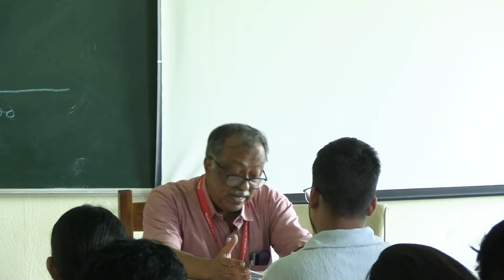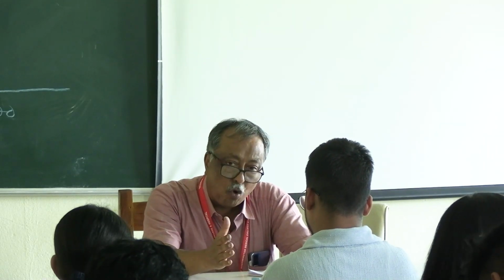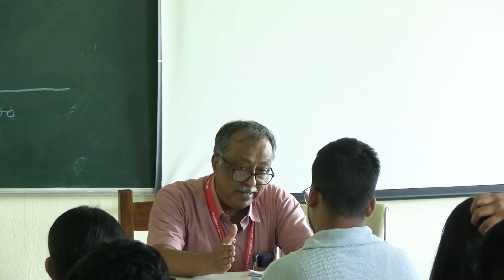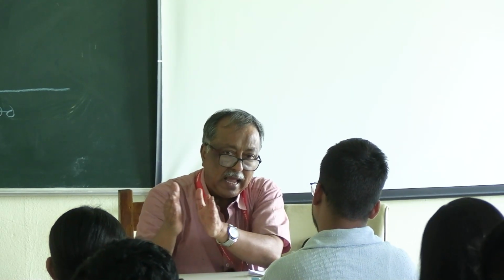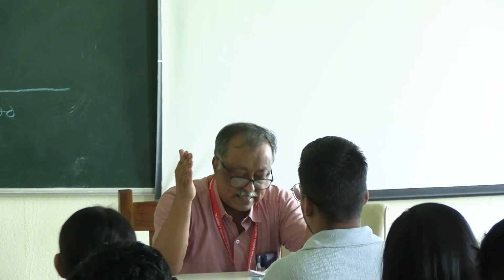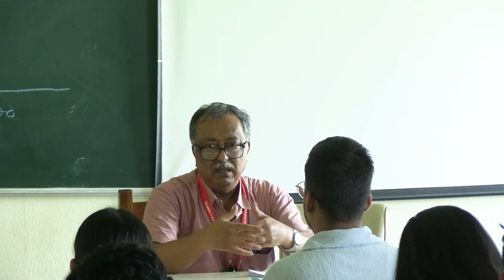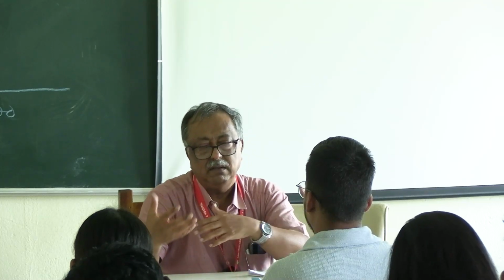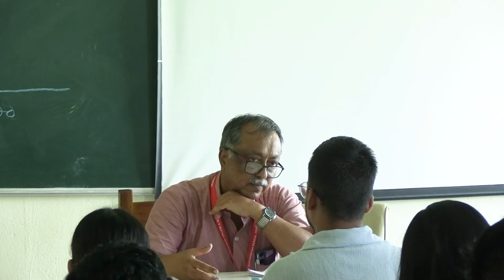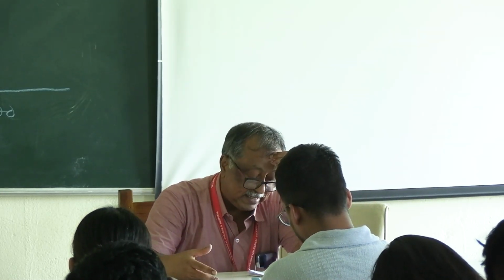The difference between the comfortable level and the loudness discomfort level in case of cochlear involvement is the dynamic range. That means the range between the discomfort level and the comfortable level. This range is reduced. You quickly feel discomfort if there is damage or pathology at the cochlear level. That means a sensory pathology is there.